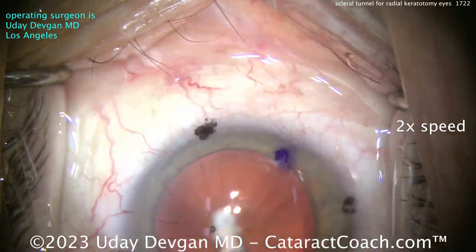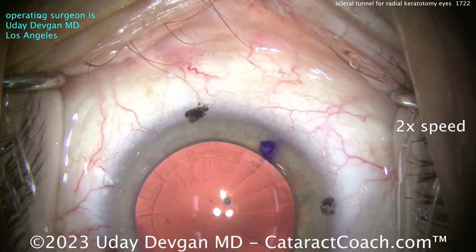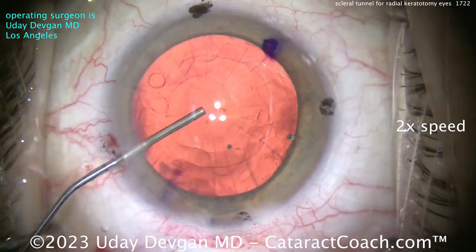We'll clean up that capsule bag nice and easy — that looks great. Fill up the bag and we'll get our toric monofocal lens in there.